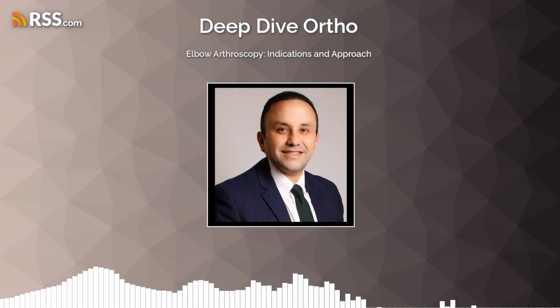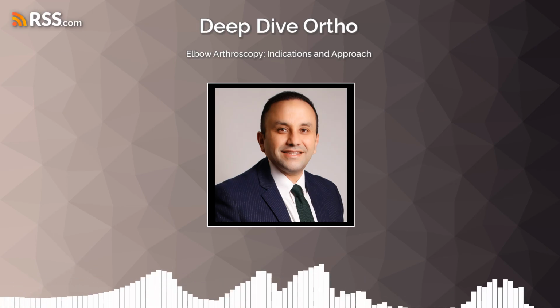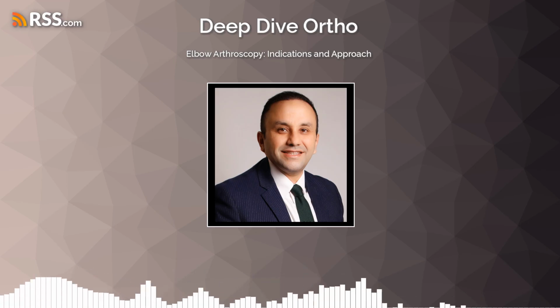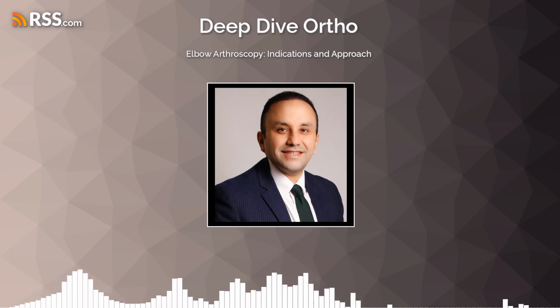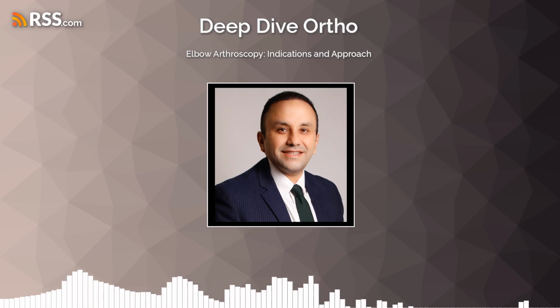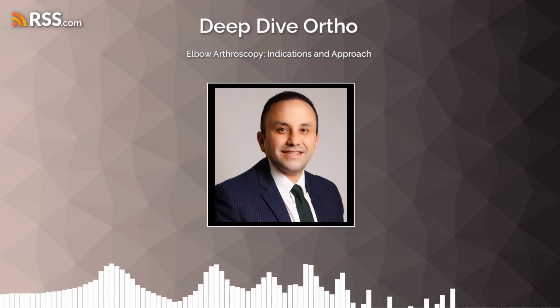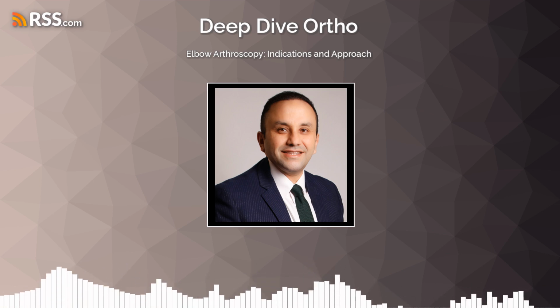Postoperative management for arthroscopic radial ulnohumeral ligament, or RUHL, repair typically involves a posterior splint with the elbow flexed to 30 degrees for 5 to 7 days. Subsequently, a hinged elbow brace allowing 0 to 45 degrees of flexion is used for 6 to 8 weeks. Tensioning the repair is performed with the elbow in pronation and 45 to 60 degrees of flexion to prevent any over-tightening. Full range of motion is generally expected by 6 to 8 weeks, followed by progressive exercises and strengthening.